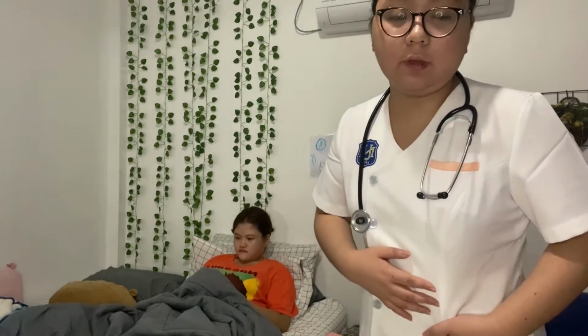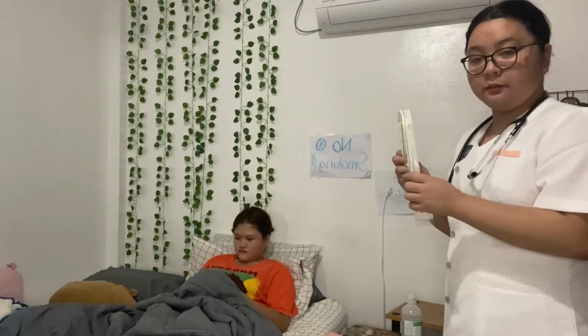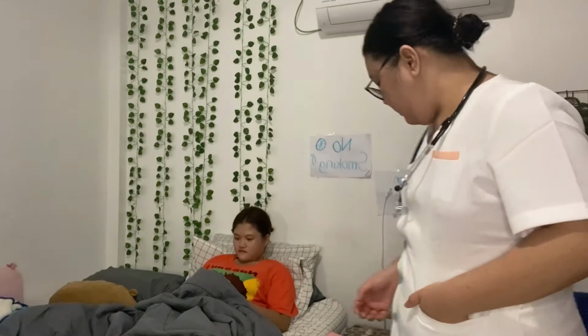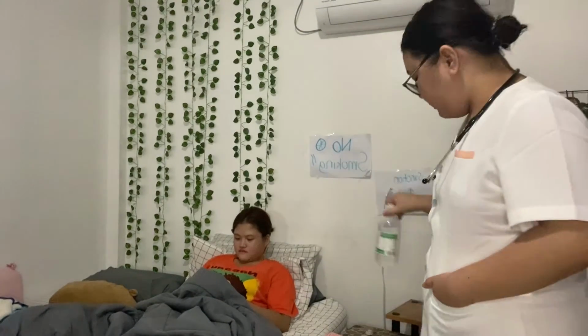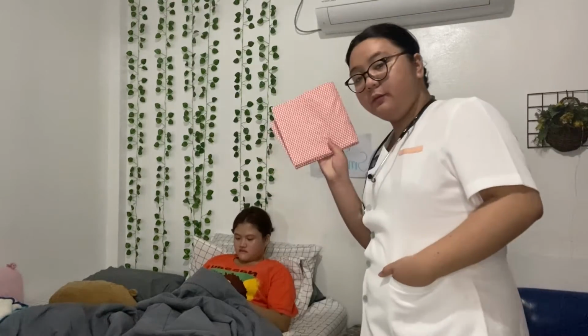The first one, I need a bedside table, which is in here already, and also the suctioning catheter of appropriate size. It's in here. Plus the sterile basin, which is this one. And then after that, approximately 100 ml sterile normal saline, which is this one. And also a clean towel and sterile drape from the kit. Here's the clean towel.